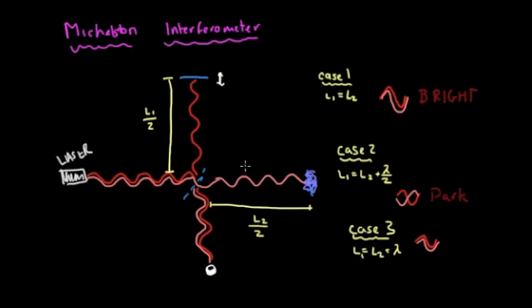But I want you to consider, what if we have a reflective structure down here and a reflective structure way out this way? What happens then? Can we get this interference? And the problem is that with this, we don't really know what is being interfered, what the light is bouncing off of. Some of the light might be bouncing off of this, and we might get an interference pattern from this. Some of it might be from the same distance as the mirror. Some of it might be from way out here. So we can't really localize where this reflection is occurring, and that's important if we want to recreate the structure of the tissue.